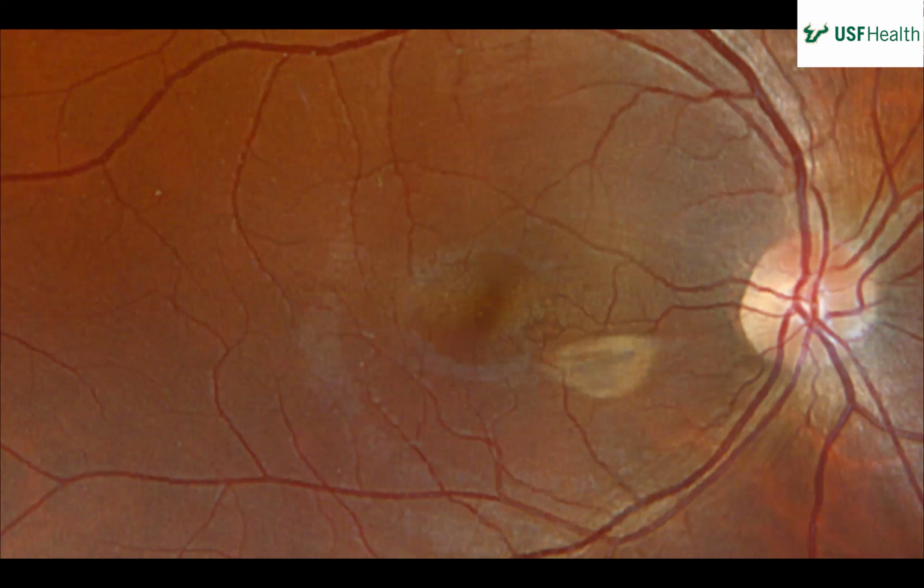Everybody can see it. And he is young too, so he's 28. He's on the sheen. Oh, okay, just a sheen. That's exactly it. But I feel like otherwise it looks pretty good, pretty normal.